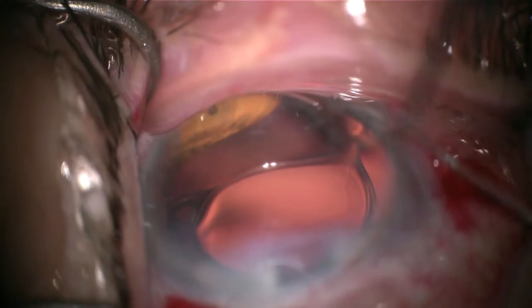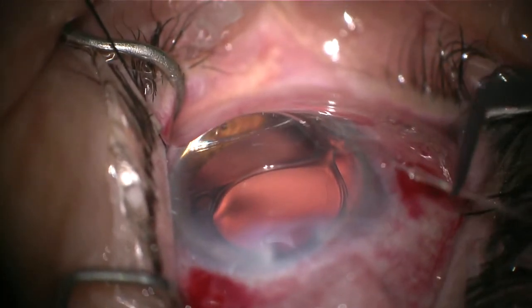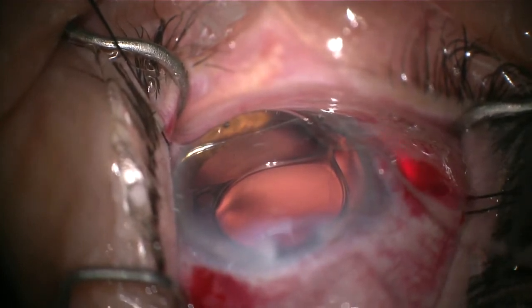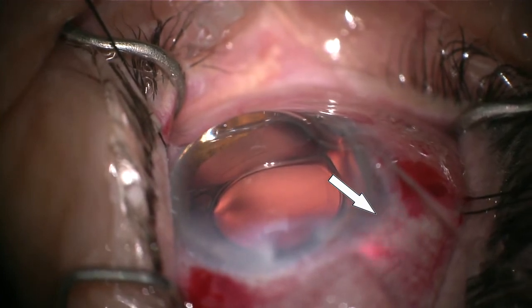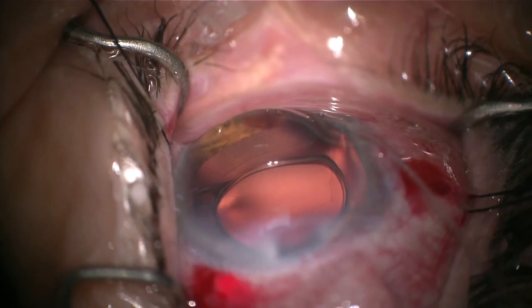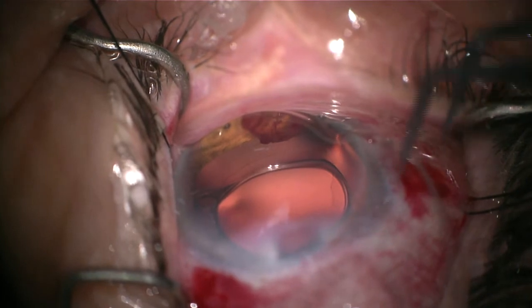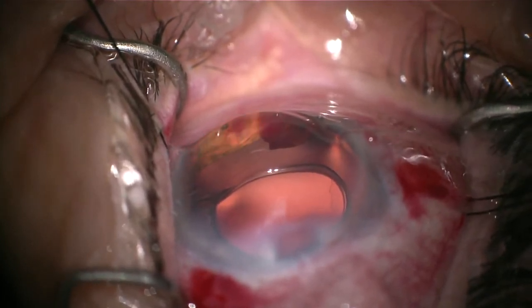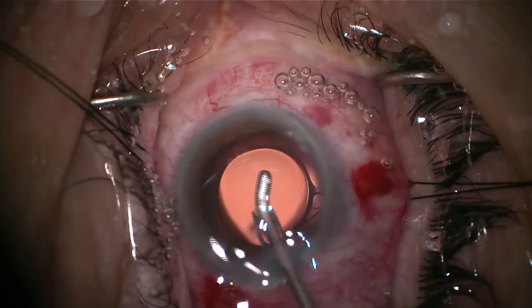Then we want to pull back, zoom out, and take our non-toothed forceps. As we pull the catheter out of the eye, we're asking our technician on the other side to click one to two clicks of Healon GV per clock hour. Basically, removing the catheter is where we're viscodilating Schlemm's canal, the distal channels, as well as the trabecular meshwork, to really dilate and help outflow through the entire natural outflow pathway — from TM to Schlemm's canal to distal channels.